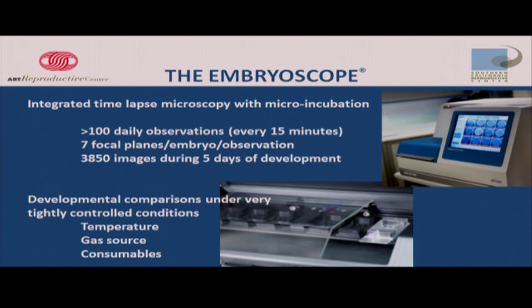So in all, as you heard from Dr. Sakis, the EmbryoScope is an integrated time-lapse microscopy with microincubation. So everything built into one box. So basically, you don't have to open it. And because you don't have to open it, you don't change the culture condition. It is the most optimal it can be the entire time it's in there, giving it the best chance to survive. Anytime you go outside of the normal, optimal environment, you are compromising the future development of that embryo. So in this case, you don't have to take it out.